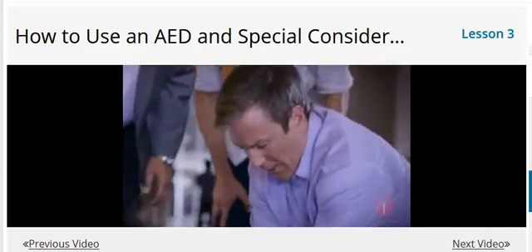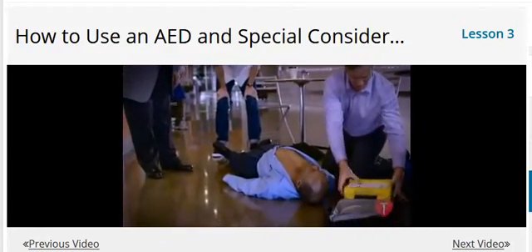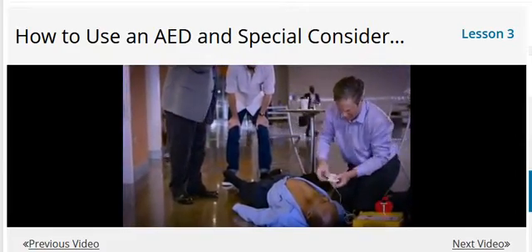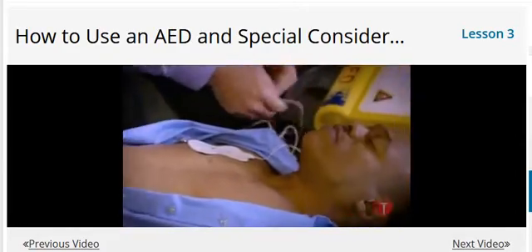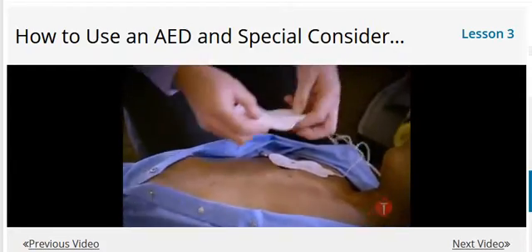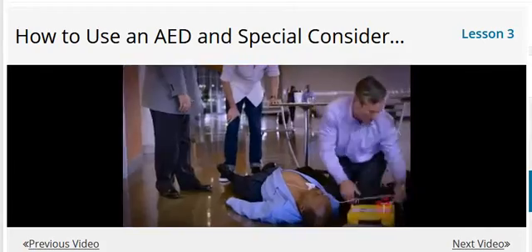28, 29, 30. I got the AED, but I don't know how to use it. I got it. I don't know if I can answer all of your questions, so I'm going to put you on speaker mode and put the phone next to the man who's helping him. This is the dispatcher. Can you hear me? We have an AED. I'm attaching pads now. Yes, I can hear you. Plug in pads connector.